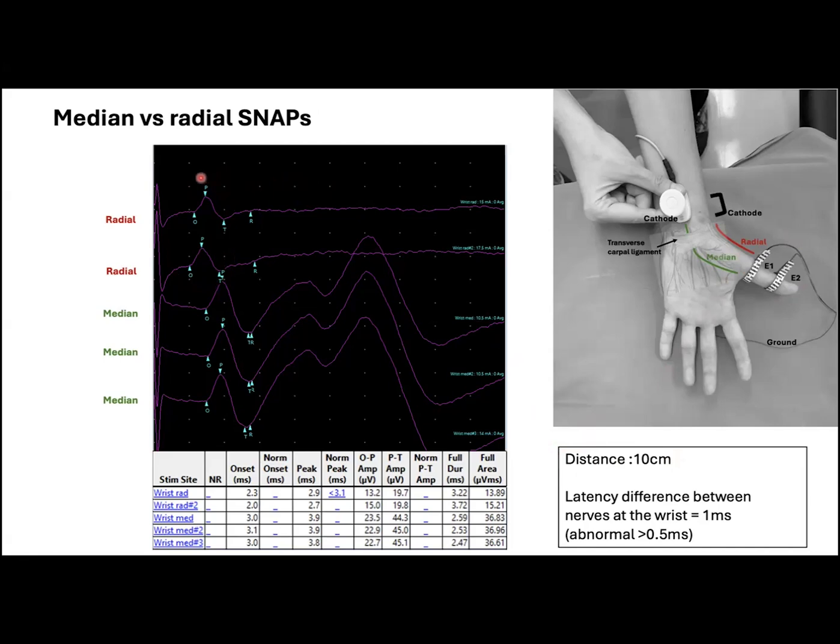Here we can see an example of insufficient stimulation, where the radial snap has prolonged latency and reduced velocity, as compared to the second tracing, where a higher intensity produced normal responses.